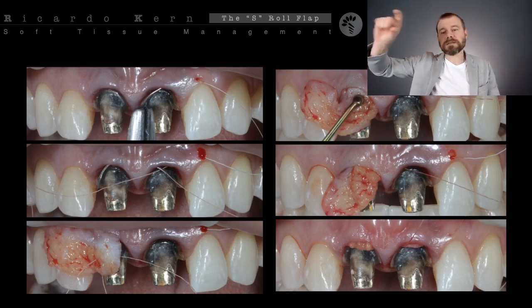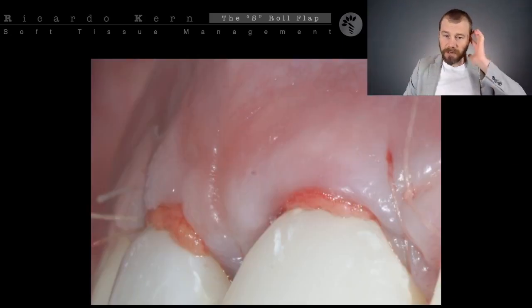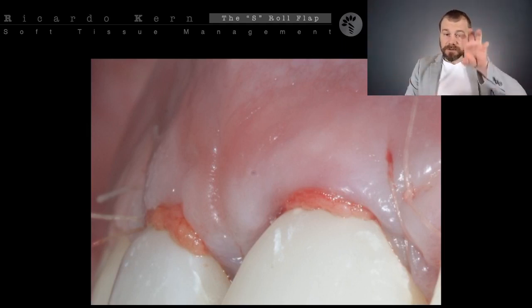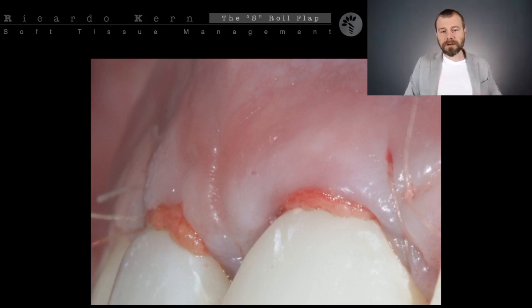So we have one side aligned, the other side aligned, and you have a middle suture between the two crowns. We're going to talk about that later, how to design these sutures and how to do the central sutures. That is very important. And we align this connective tissue border to border.